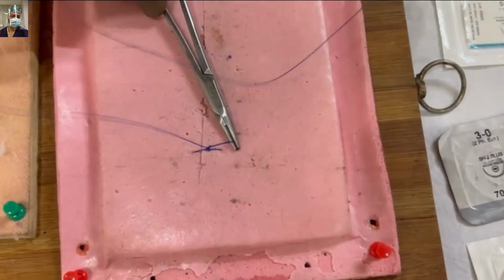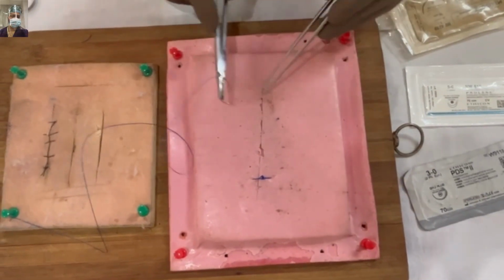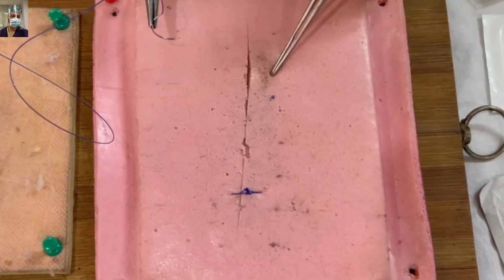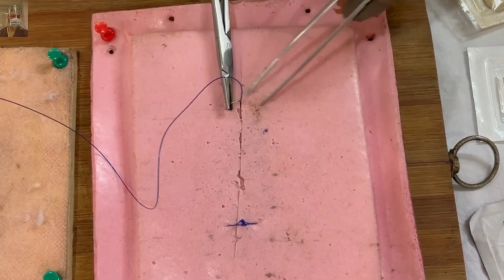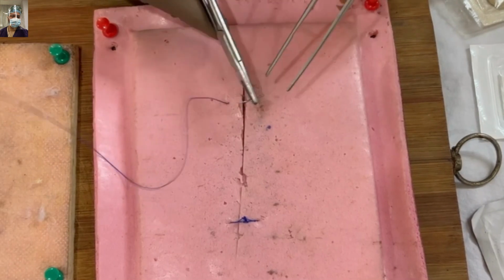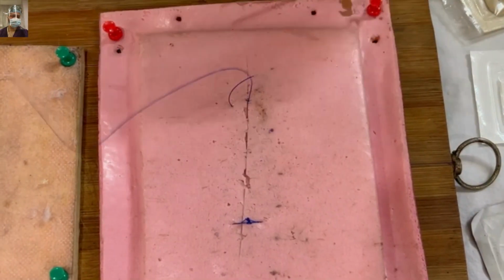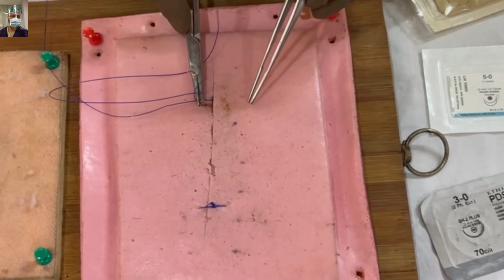So keep your canvas ready, find some suitable corner in your room or in your house, and start practicing the suturing technique. Again, I am repeating here: follow the curve of the needle. How to hold the needle I have already discussed. It can be 2/3, 1/3, the anterior 2/3 and posterior 1/3 junction, or half, whatever you prefer. So the entry and exit points are at the same level, the same horizontal plane. And if you want a bigger circumference of the tissue, then you hold 2/3, 1/3. Otherwise, half circumference is okay.